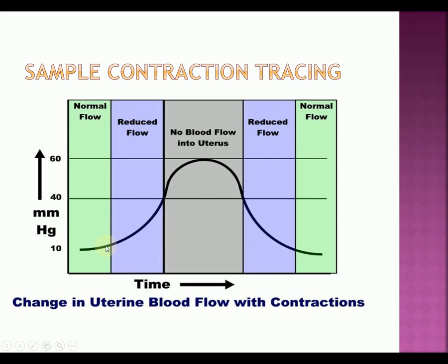You go all the way over to the beginning of the next contraction, and then measure how many minutes that is. You can't tell minutes here because we don't have it lined up for you, but that's how you would measure it, from the beginning of one contraction all the way to the next. Then we'll talk a little more about how to measure it on the fetal strip.